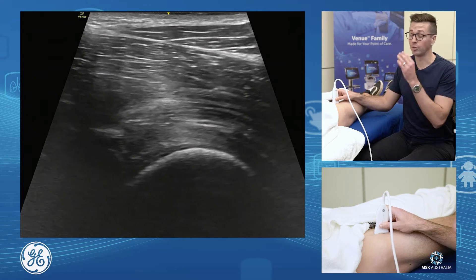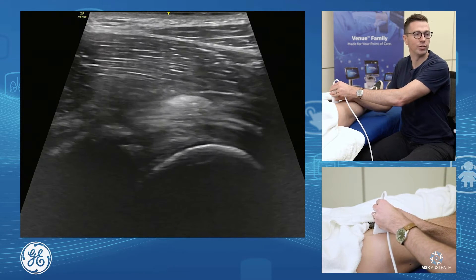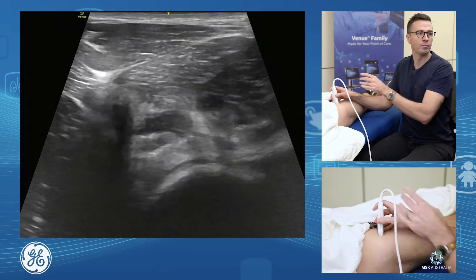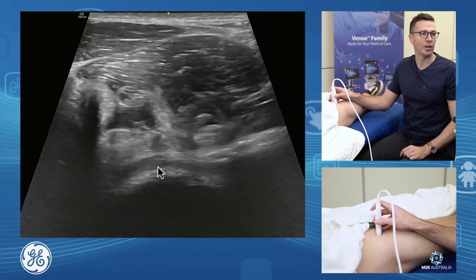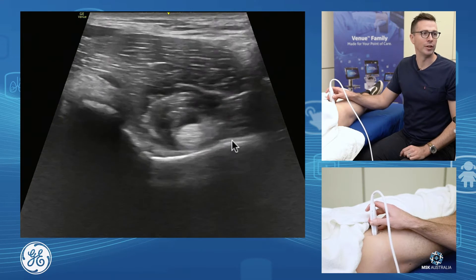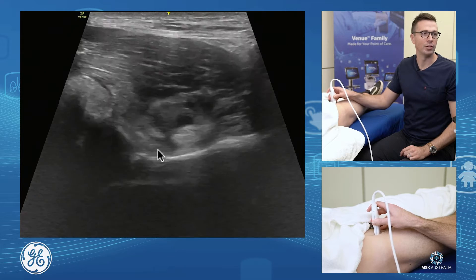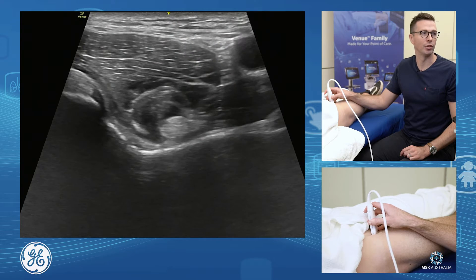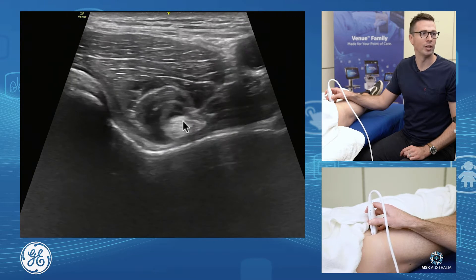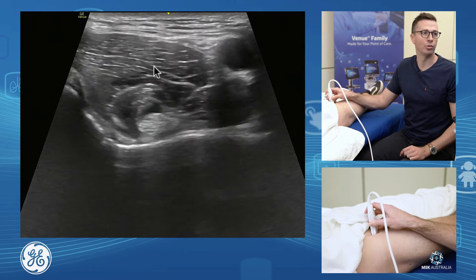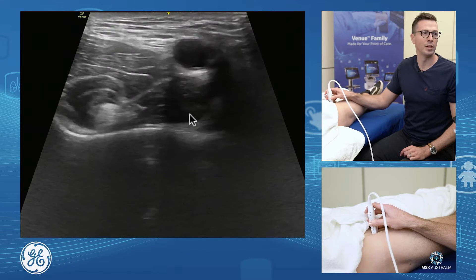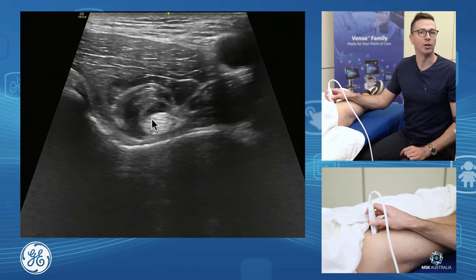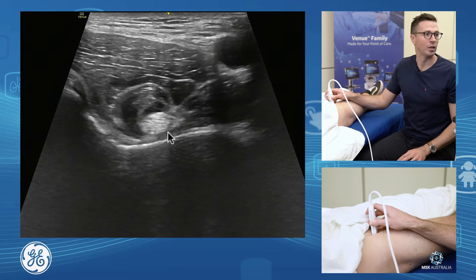From here, we're going to assess our iliopsoas complex. From the front of the joint, we get on that femoral head-neck junction and turn our probe 90 degrees. Here we are on the femoral head, scanning up onto the iliopectineal eminence of the acetabulum. We have the femoral head, acetabulum, and our iliopsoas sitting on top — with the medial fibers of our iliacus, lateral fibers of our iliacus, residual fibers of our psoas, and the neurovascular bundle sitting medially. We see our iliopsoas tendon sitting nicely on the iliopectineal eminence of the acetabulum.